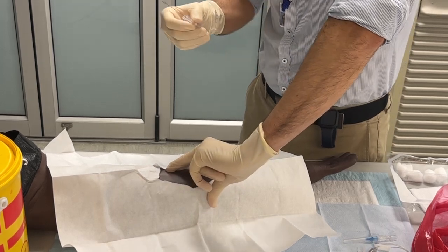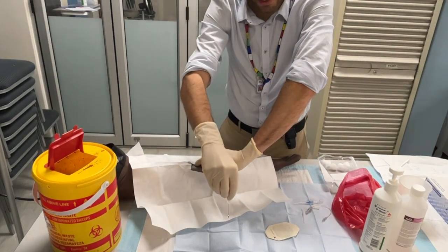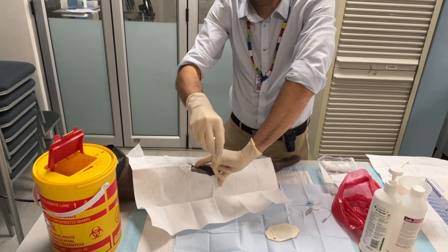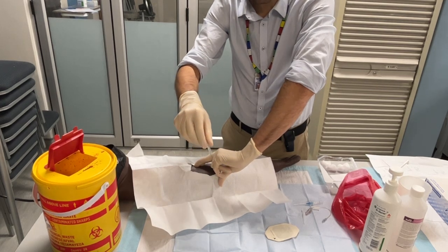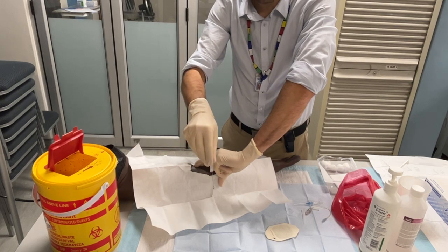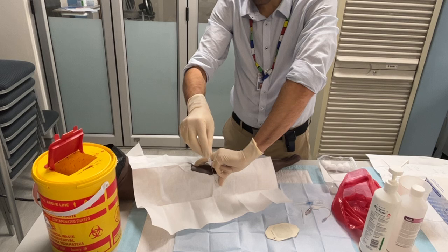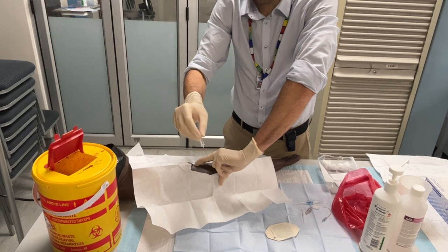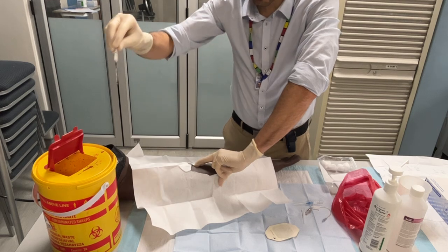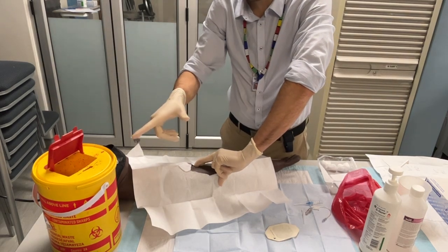What's important is I don't leave it lying on the side here, I don't prick it into the bed — I throw it directly into the sharps container. If you leave it in the bed you might forget it, and someone comes and changes the sheets and they prick themselves. Also, putting blood into a patient's bed is not ideal from an infection prevention point of view. Please, as soon as you take out the needle, just discard it directly into the sharps container, which is right next to me.